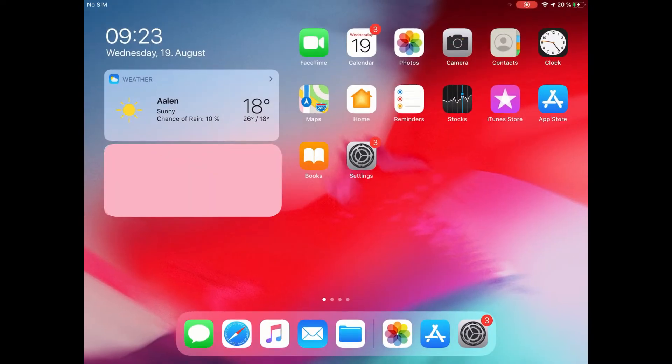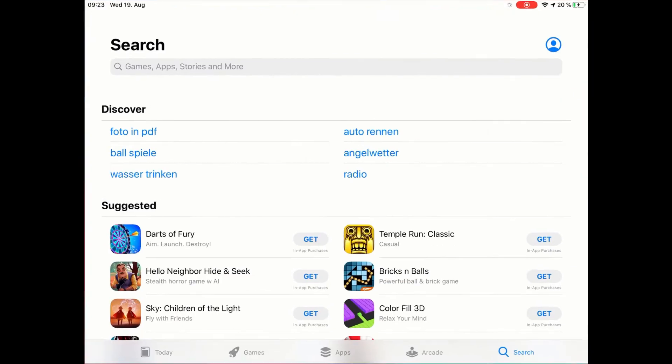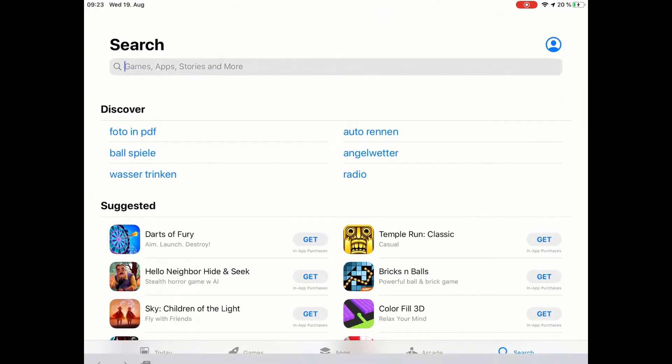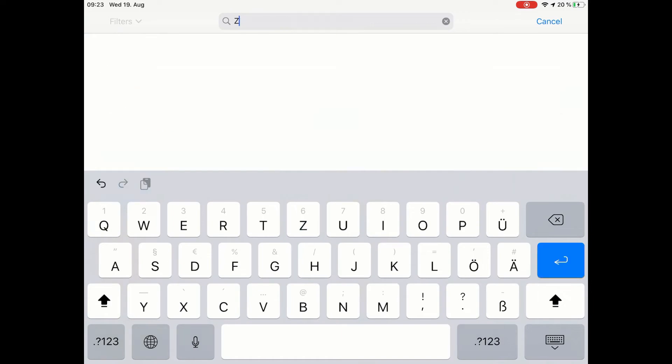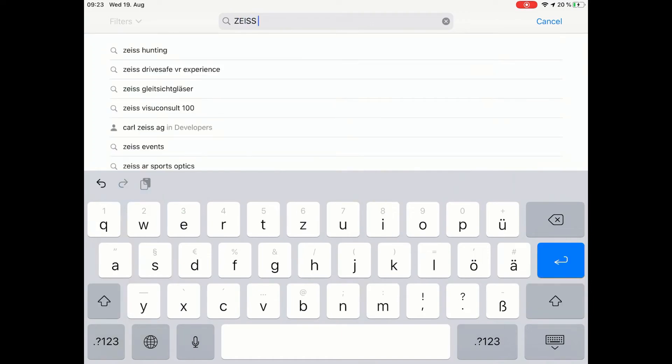ZEISS Connect is freely available on the Apple App Store. By providing your Apple ID information, you can download it directly to your iPad.